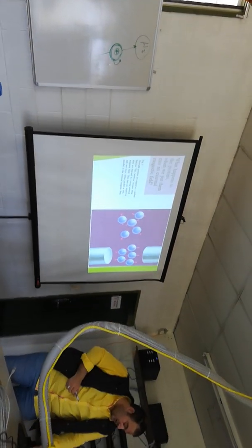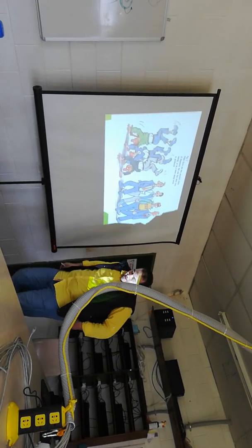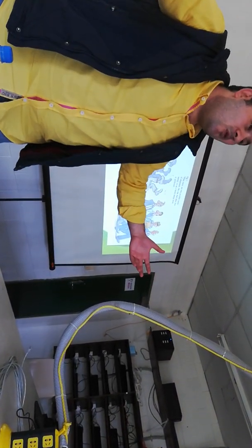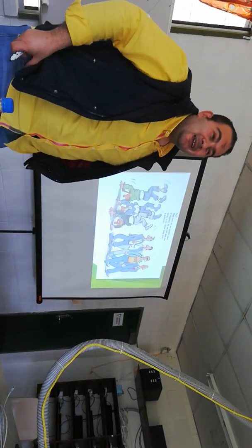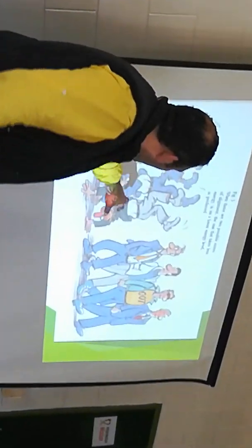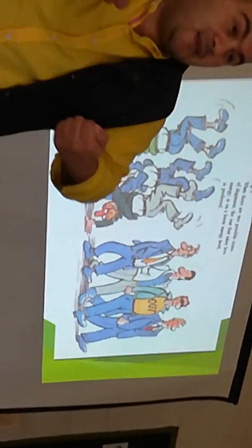Like what? Like people moving on their feet, they are relaxed. Now protons which are moving parallel to the magnetic field are relaxed. No need for more energy. But other protons moving on their hands, they need more energy.